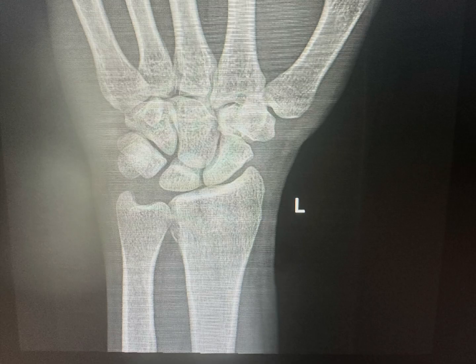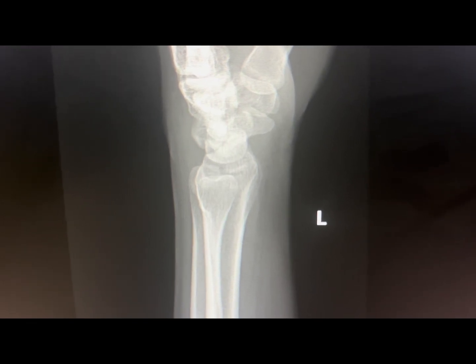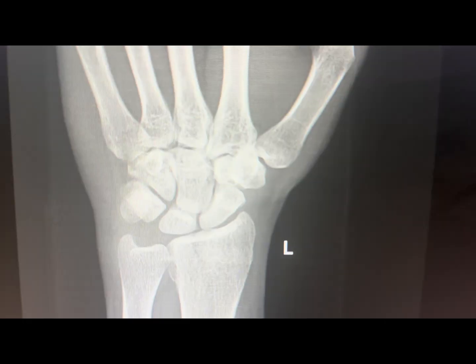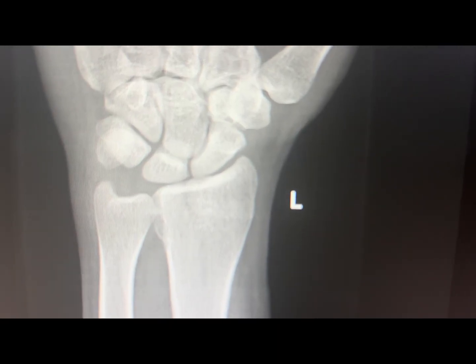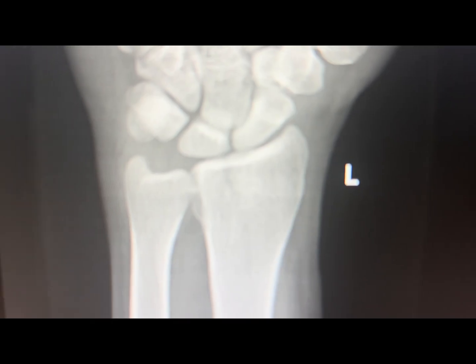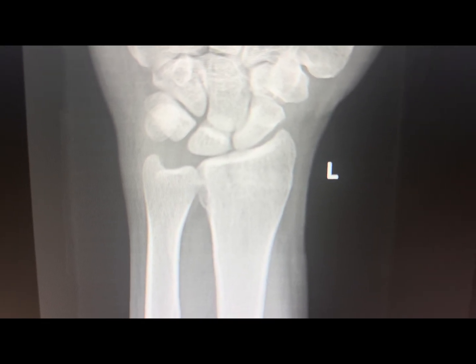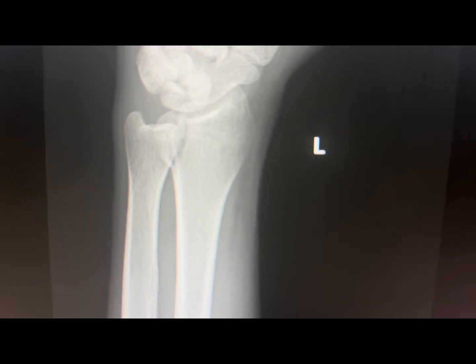This is the X-ray of a 32-year-old gentleman with an intra-articular dorsal Barton fracture. There is a step of more than two millimeters, which we measured on the CT scan. I am now going to put the dorsal plate and take you through the further steps of the surgery.